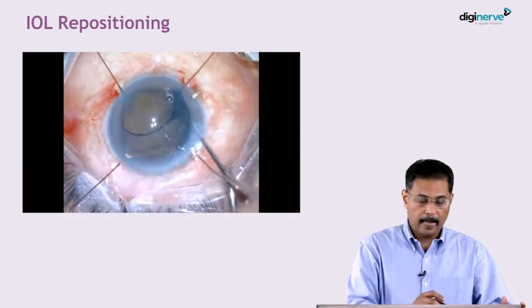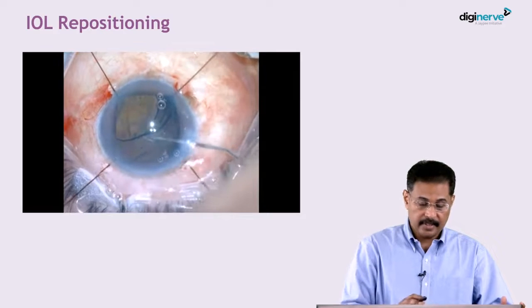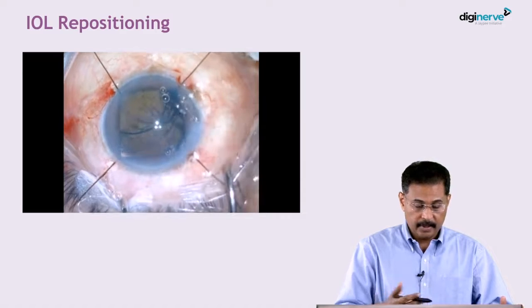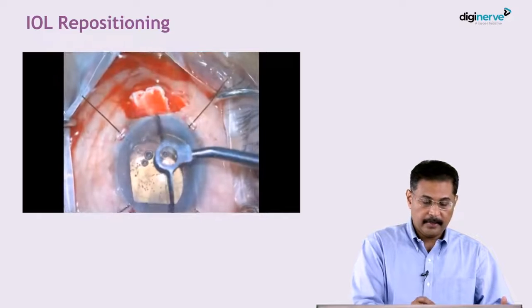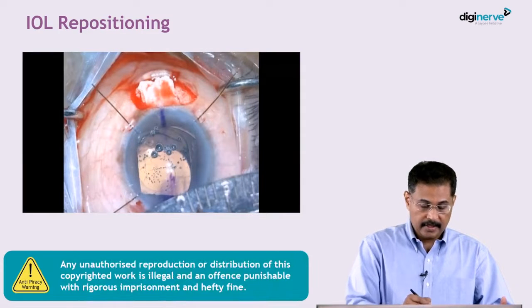We can notice that the whole bag complex is lying free on the anterior vitreous face. We put cohesive viscoelastic inside the anterior chamber above and below the lens to separate the vitreous so we don't come into contact with it. Then, 180 degrees apart, we create two partial-thickness scleral flaps and mark 180 degrees.